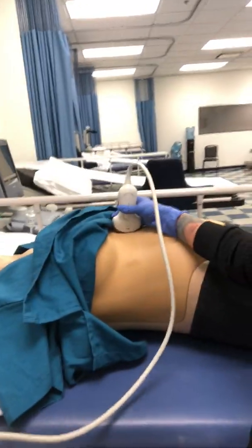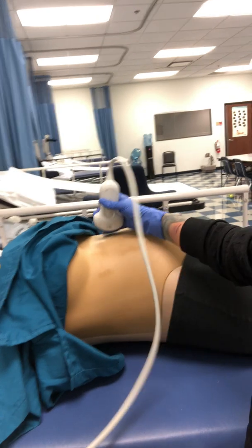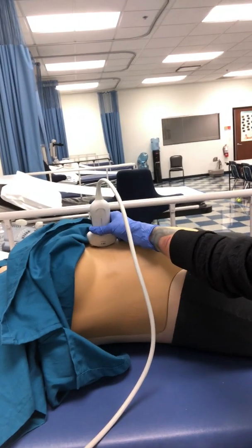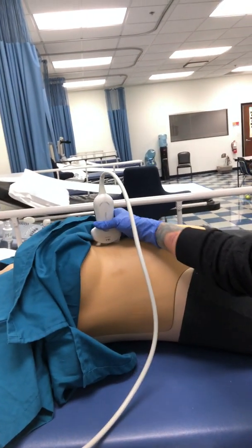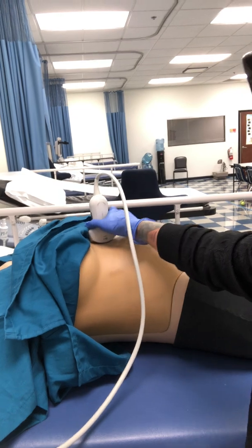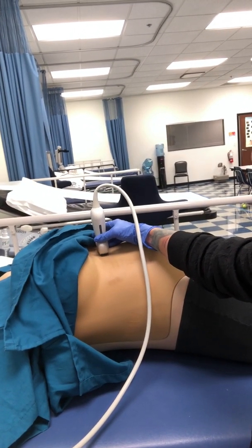If we're in a sagittal cut, you can see the superior and you can see the inferior, because our notch is pointing superior and the exact opposite side is pointing inferior. But you would have to physically sweep right or left to see right and left. Now, with the transverse cut, you can see that our notch is pointing towards the patient's right.